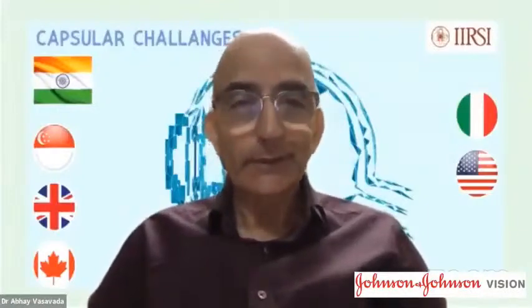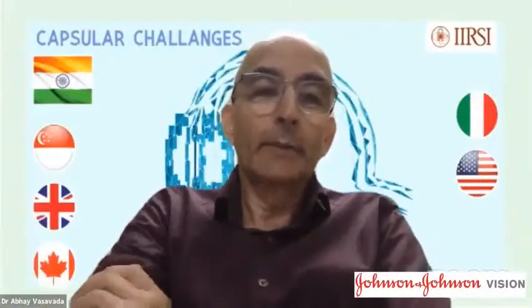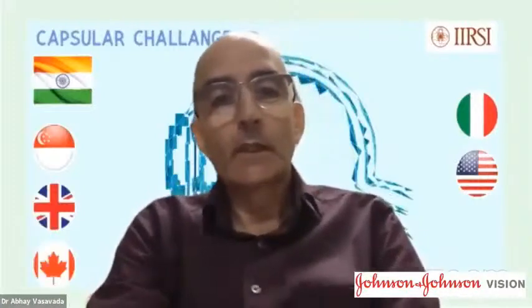I would add, make it half a diopter myopic. I do not see that it can induce astigmatism. And I do not use multifocal lens because I use a three-piece IOL and I don't have any three-piece designed trifocal lens with me. Yeah. So I think half a diopter more. I think we have overshot time.